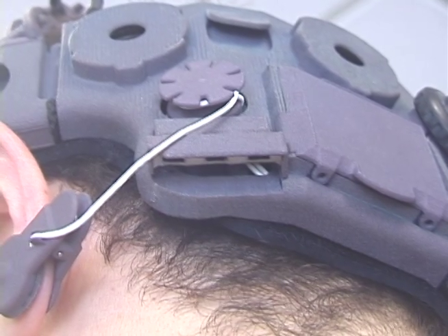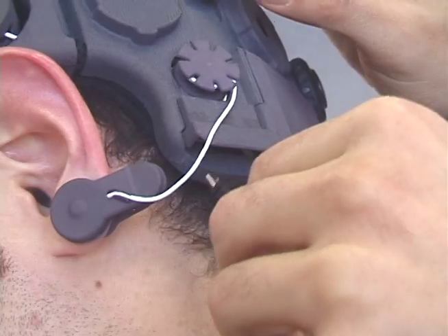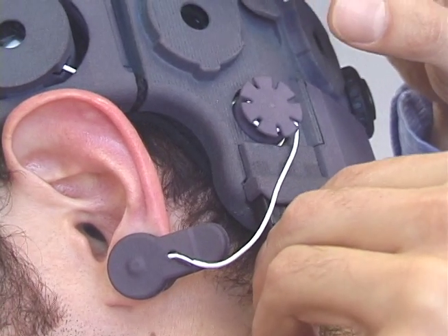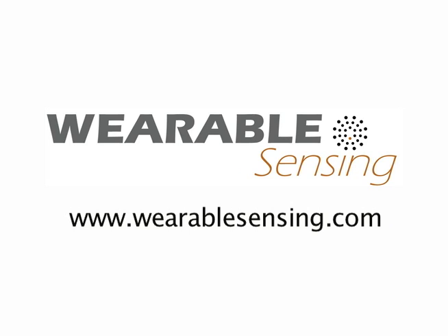If you need to connect EMG, ECG, or other devices, there are three mini USB connectors underneath the spool for the left ear clip electrode. View the DSi setup video to verify signal quality before starting to record EEG signals.